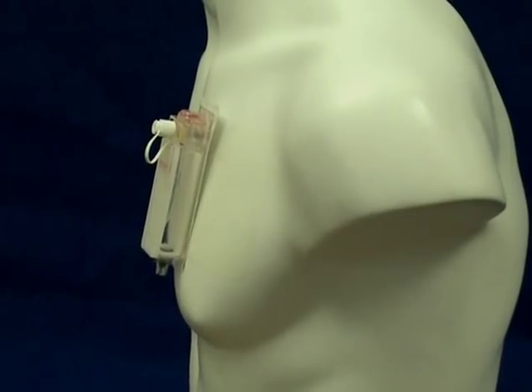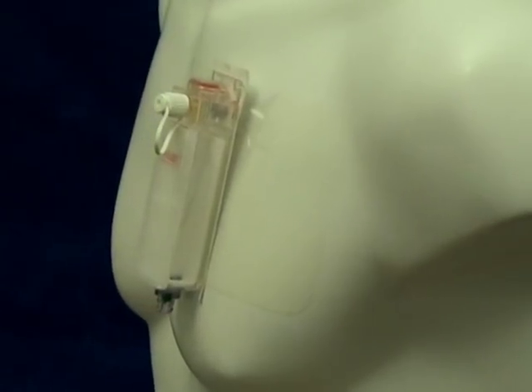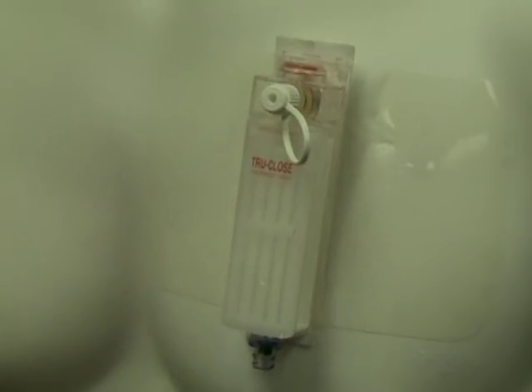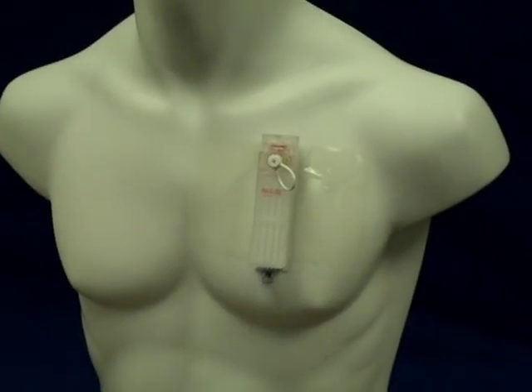This film demonstrates the advantages and superiority of the TruClose Thoracic Vent. The device can be quickly and safely introduced under all conditions and settings and is a reliable technique for managing simple pneumothorax.